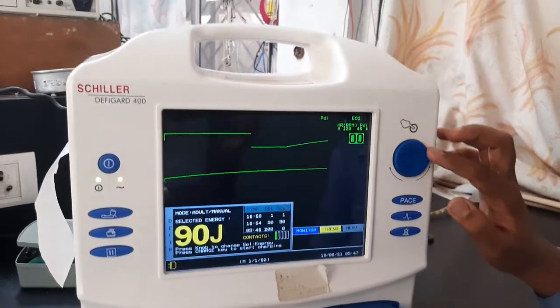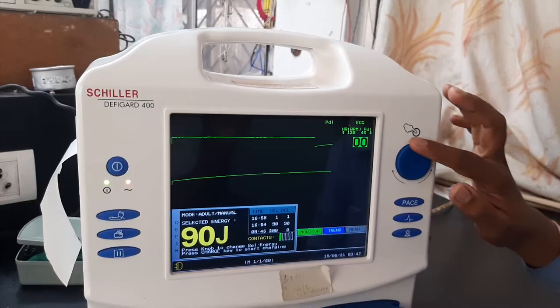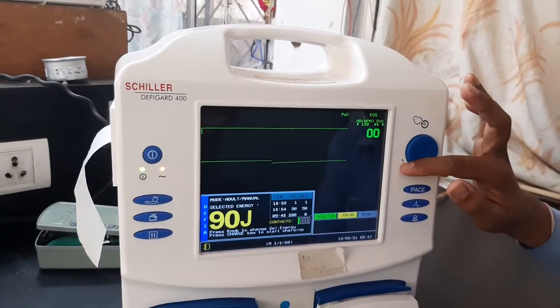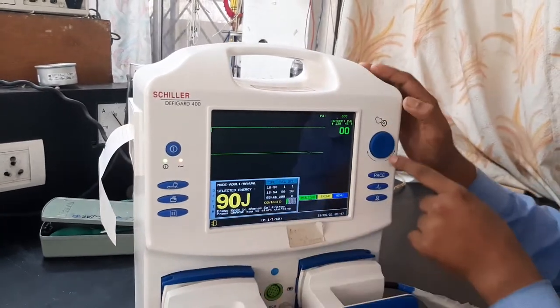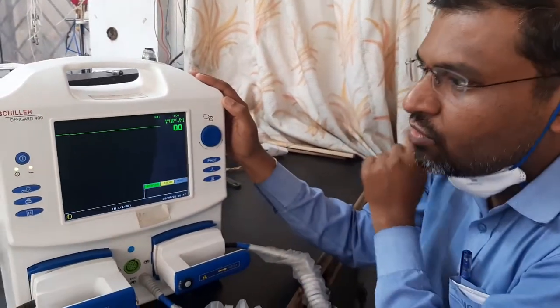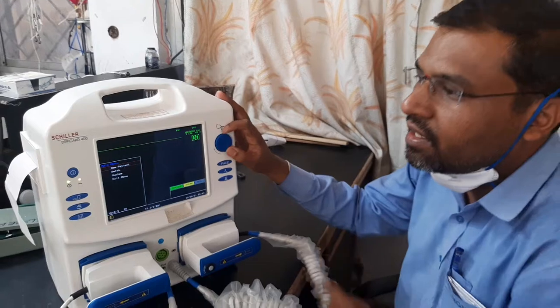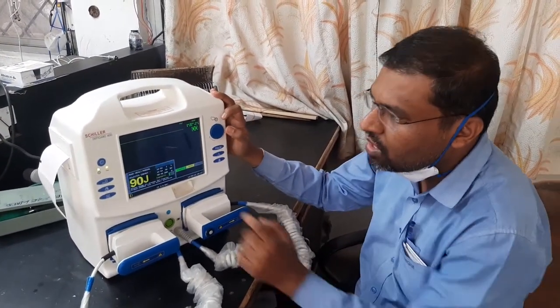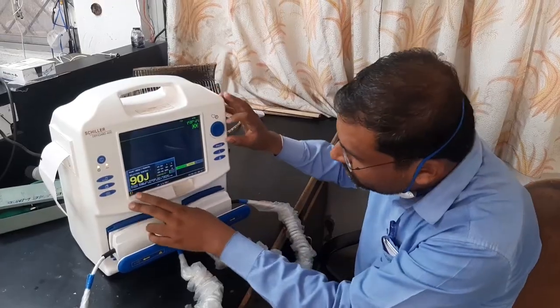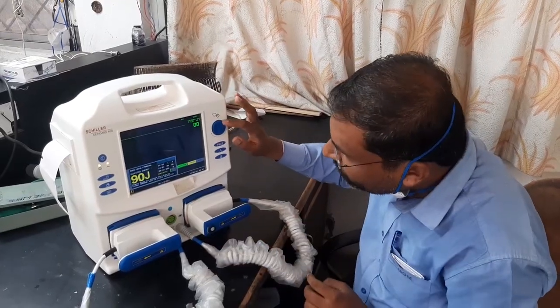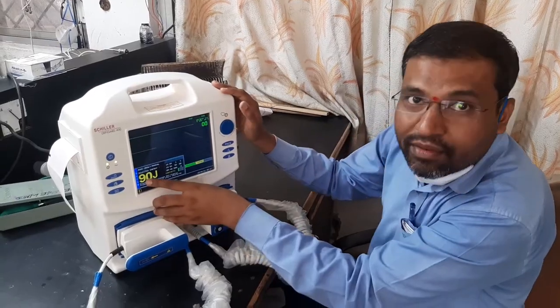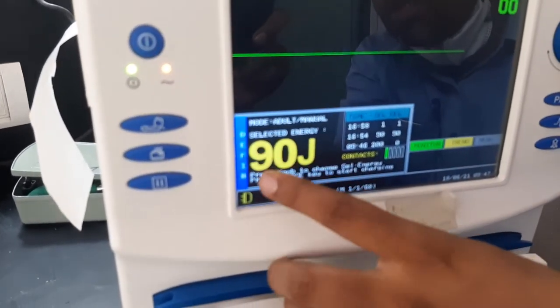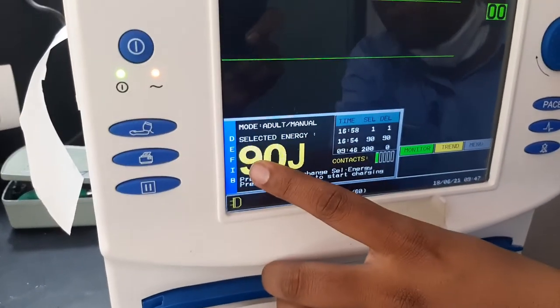This knob works like a mouse on a PC. With the help of this knob you can select a particular parameter, and by clicking it you go inside that parameter. To select energy, rotate the knob to navigate to 'Defib' — you can see the cursor move to the Defib option.